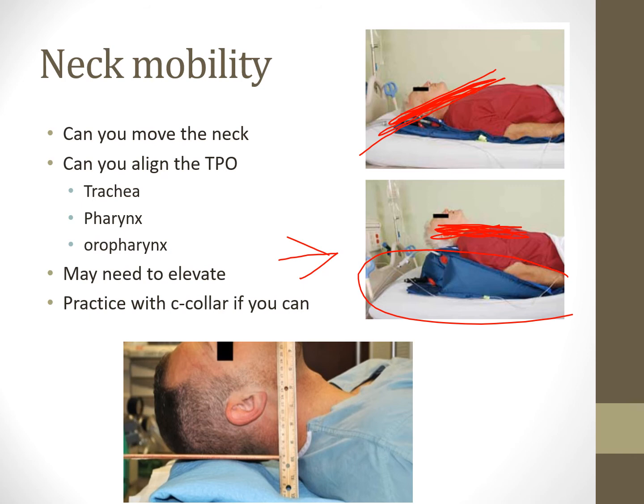Ideally, if we could practice with the C-collar on our mannequins, we should. But yeah, just make sure that ear is in line with the sternum.